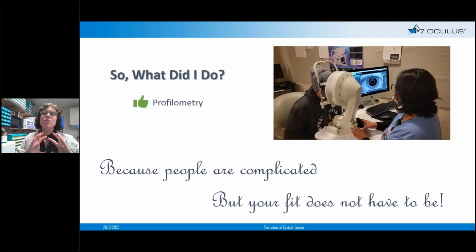All right. So again, I like to say I use profilometry because people are complicated, but your fit does not have to be. And this lets me spend more time with the complexity of the patient. What's going on? Are they potty training their puppy? All the things that the patient finds important, because they just assume that the contact lens is going to fit. Okay, next slide.